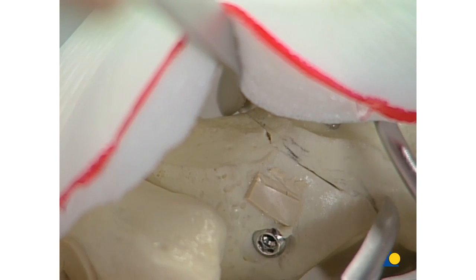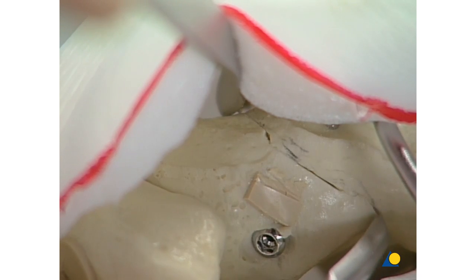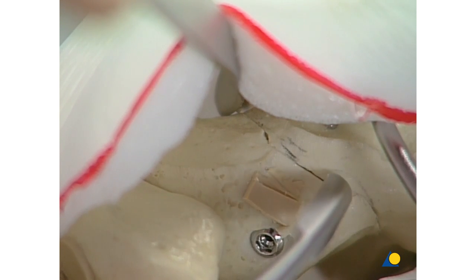Control of the reduction using the small elevator before and after removal of the reduction forceps.